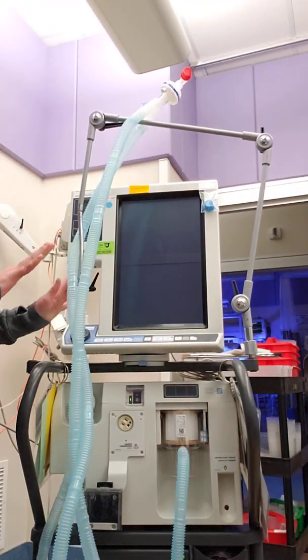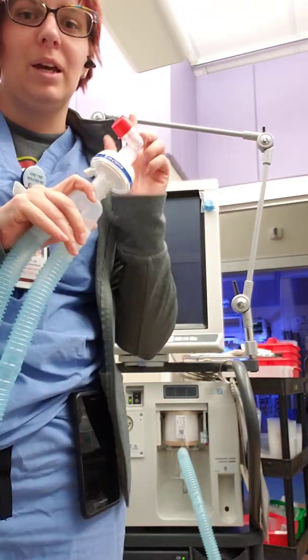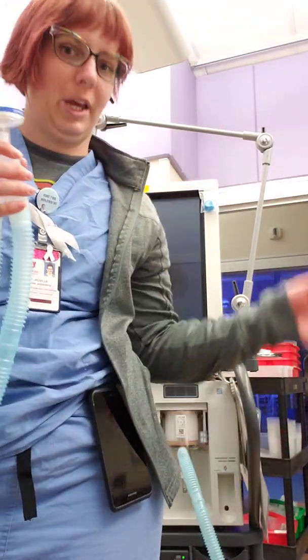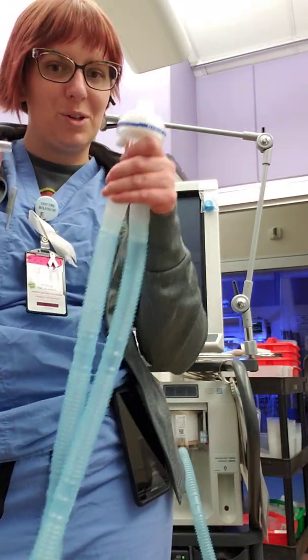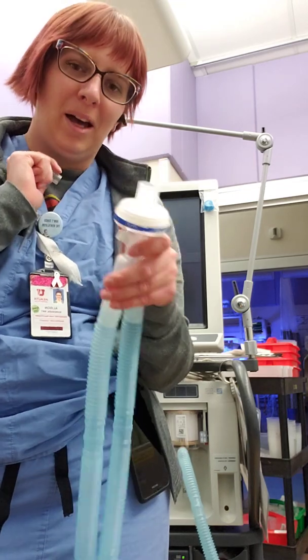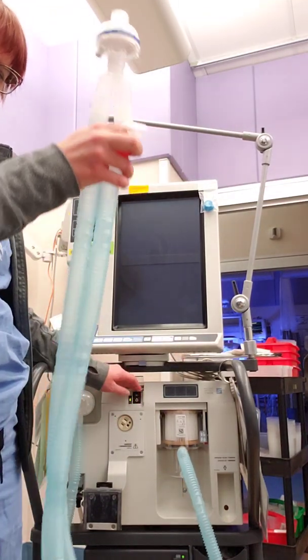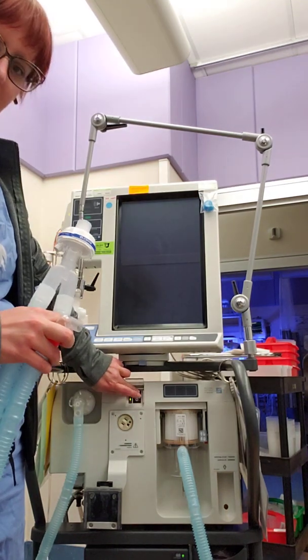All right, so we have our vent. One thing that's specific with the Puritan Bennett, but not other ones, is they start when flow is interrupted. So once we turn it on, air starts moving through this ventilator circuit, which is great, because once we put it on our patient, it will automatically start. But always make sure you unplug it. I know every single one of you will make this mistake, because I've made it multiple times. In fact, I made it last month. Unplug the top so that flow is continuous before you turn on your ventilator. Then we're unplugged here. Our circuit's up and clean. Everything's in the right place. And we turn it on.